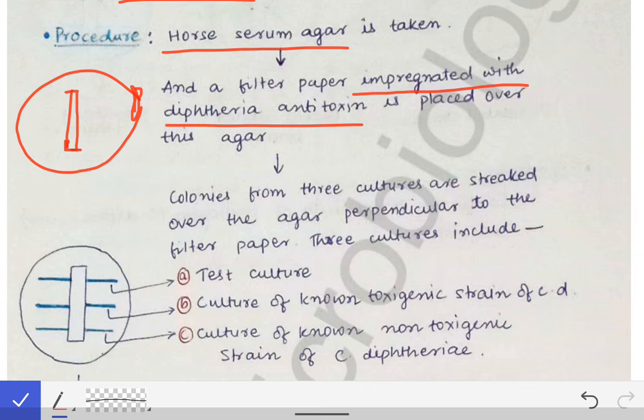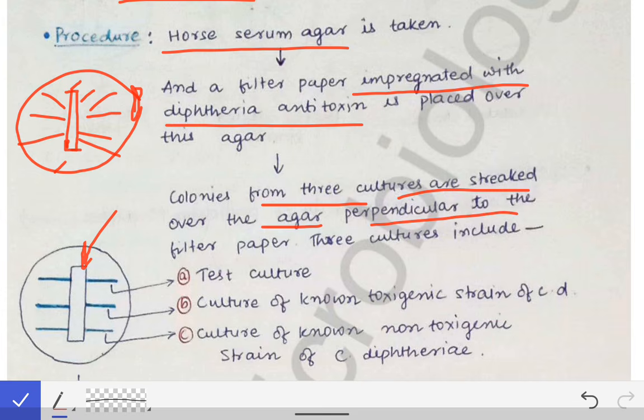So what happens, the antitoxin from that impregnated filter paper will start diffusing everywhere on that medium. Now see what we do after putting that filter paper over the agar. Once we put the filter paper over the agar, then we do streaking. And how will we do that? We'll take colonies from three cultures and streak over the agar perpendicular to the filter paper. So see here, I have streaked perpendicular to the filter paper. This is the filter paper and this is the streaking done perpendicular to it.